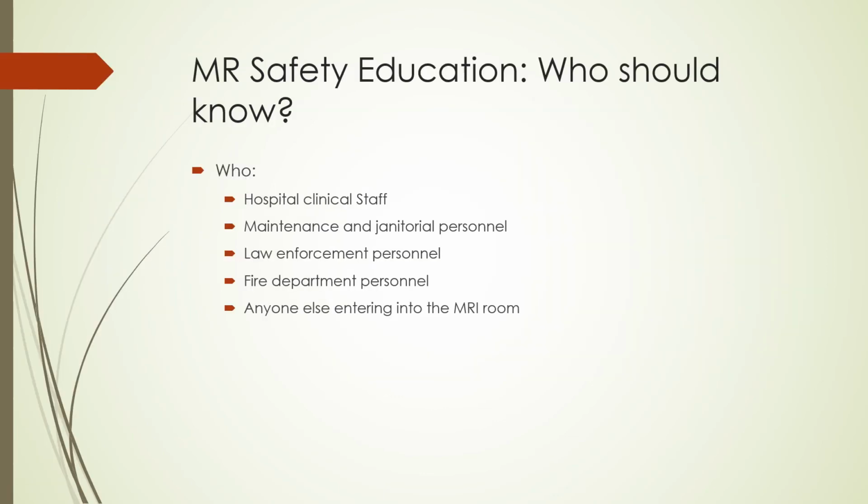Magnet safety education is an important part of a good MR imaging program. Anyone who works in an area of the hospital where there is a magnet should be educated and trained on magnet safety. It is particularly important for hospital clinical staff, maintenance and janitorial personnel, law enforcement personnel, fire department personnel, and anyone else entering the scan room or working near the magnet to have some level of MR safety education and training. On the next slides, we shall learn about MR personnel education and MR zones.